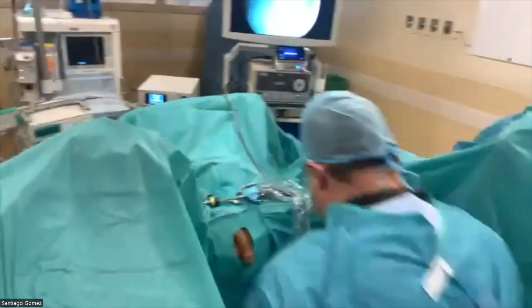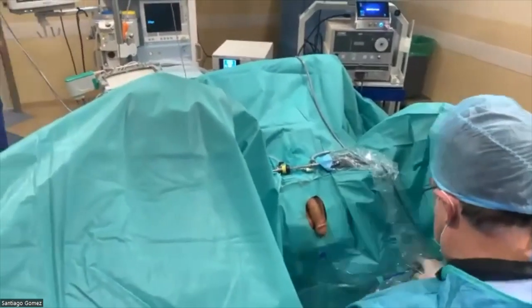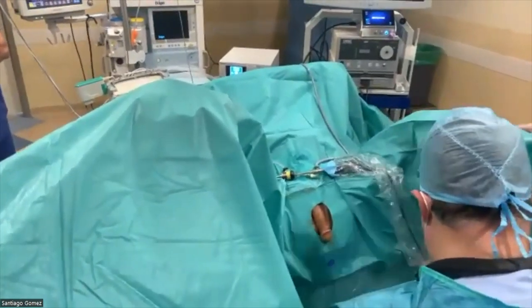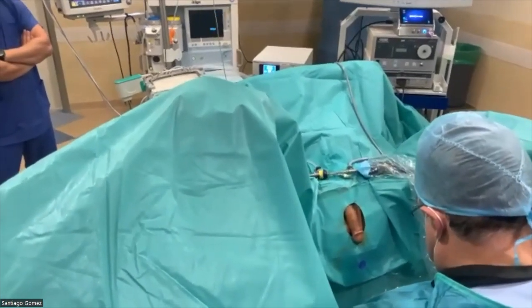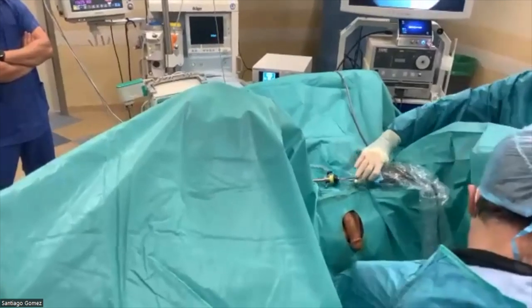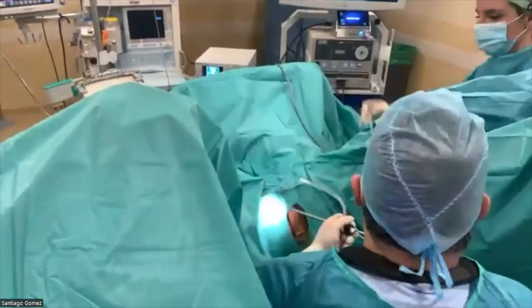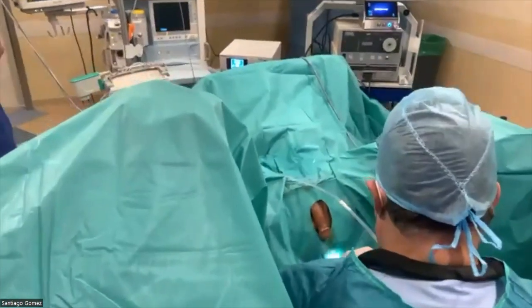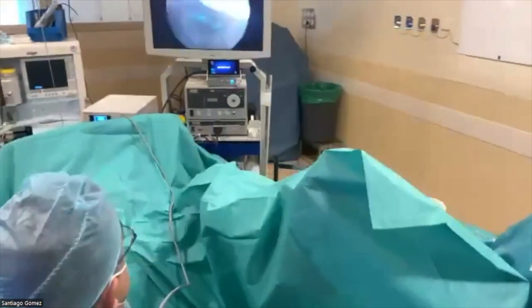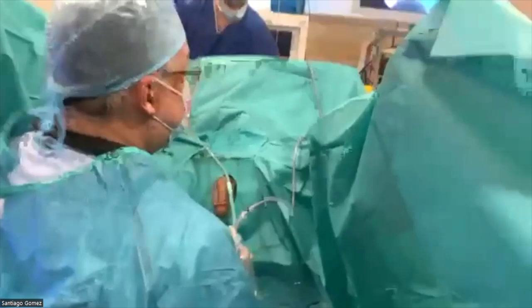because the settings tell you how the laser is coming out of the fiber. You know, these are the settings. But then, of course, the person manipulating the fiber is the surgeon. So let's do the white balance. Tenemos para white balance. So I've already done. So, you know, with the same settings, two different surgeons can have slightly different results.